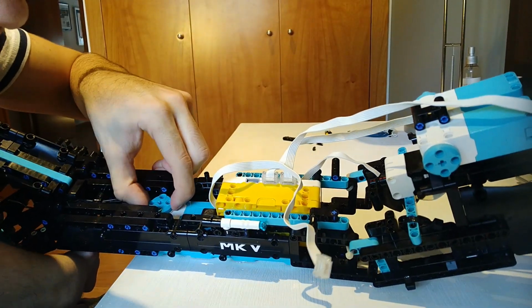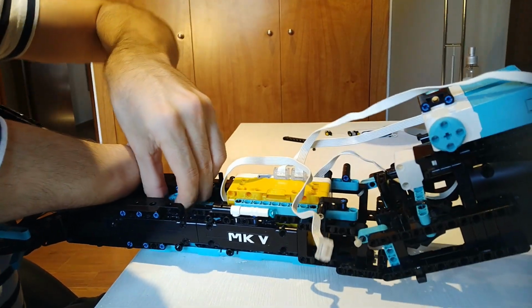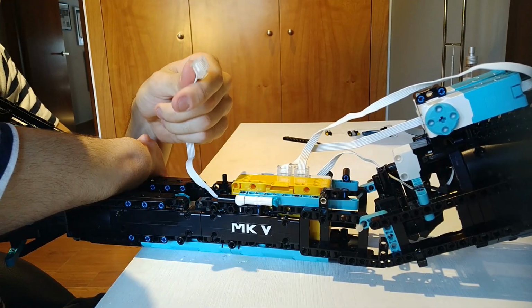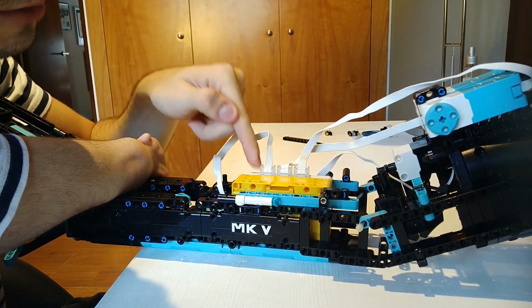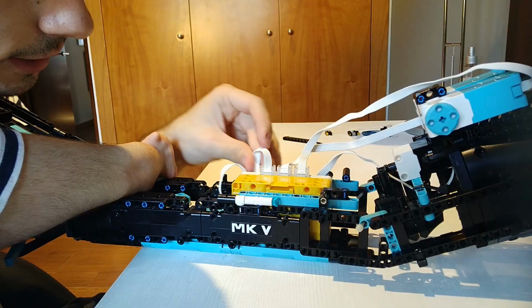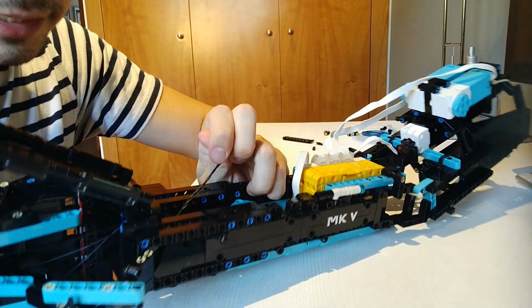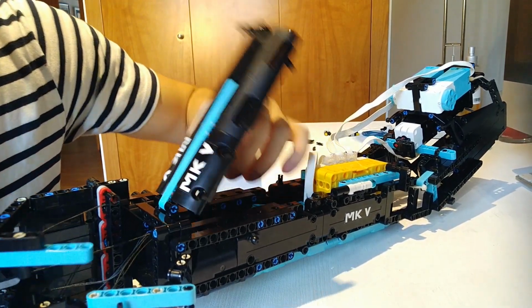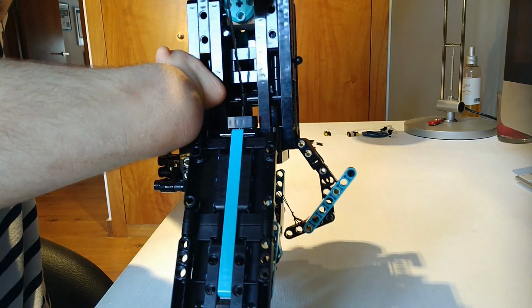And now the motor is completely fixed in the interior, so if you pull outside you can't actually pull it, and if you pull upwards you can actually pull it because it's fixed in both ways. And now you are going to connect this part right here to the first port on the top part of the prosthetic, and you need to hide this cable right here so it doesn't stay ugly on the outside. So you pull it inside like this. So the next step is actually connecting every finger to one cable and pulling the cable inside right in this hole right here.